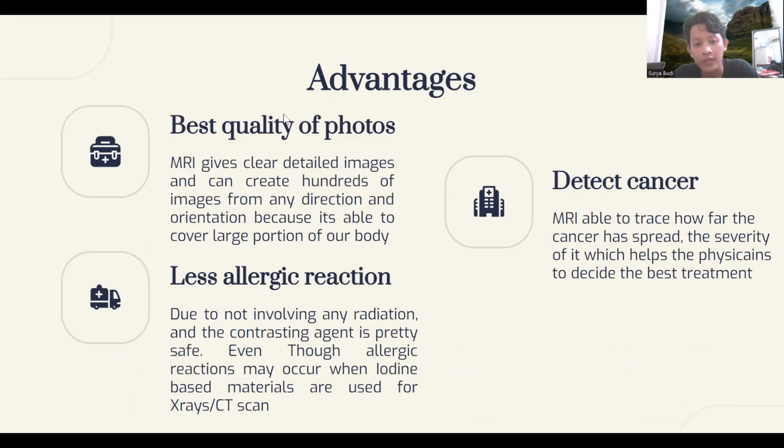So there are several advantages of the MRI. The first one is the quality of the photos, because MRI can give a very clear and detailed image. It also can create hundreds of images from different directions and orientations because of its ability to cover most parts of our body.